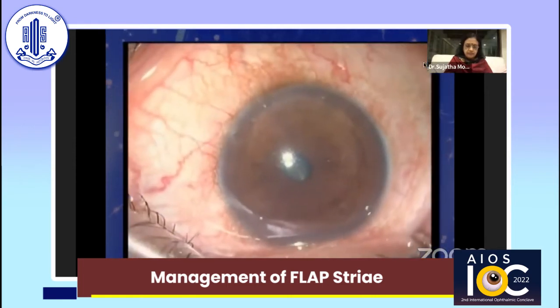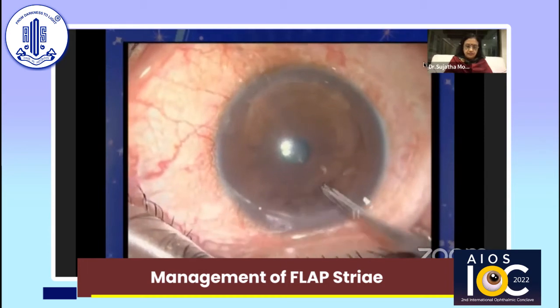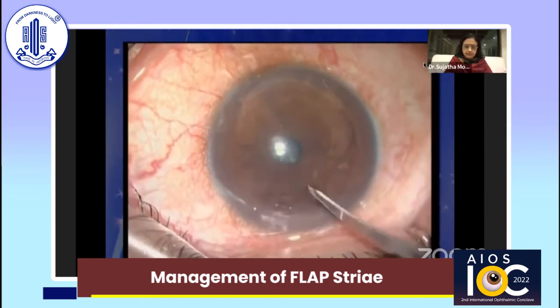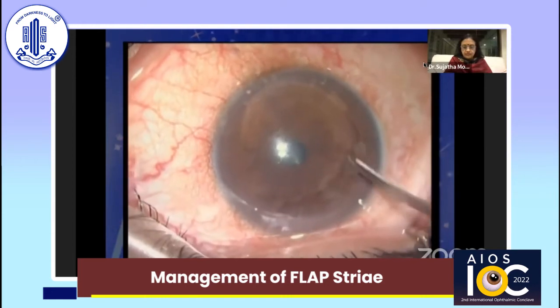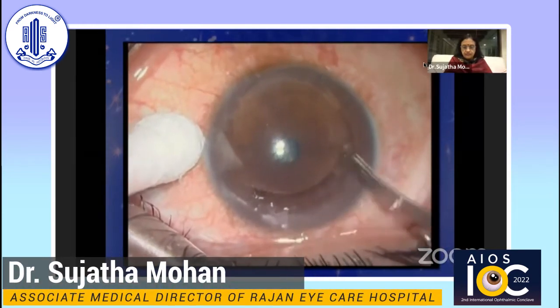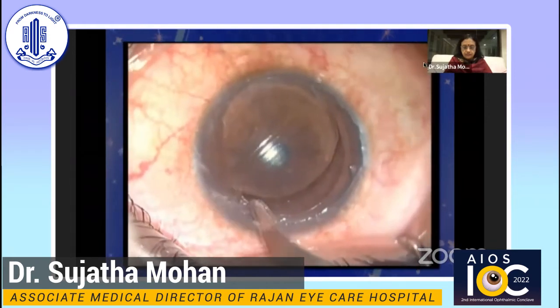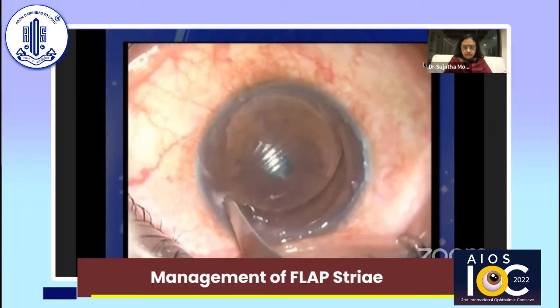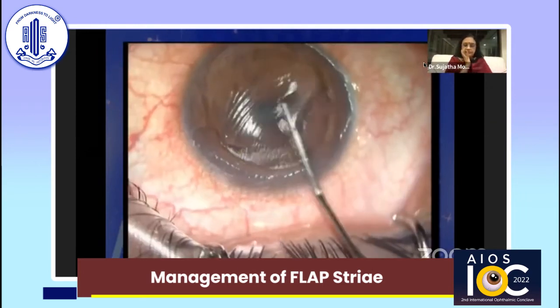The second case presented on the third post-op day with flap slippage and flap folds. Here the stromal bed is exposed with epithelial ingrowth. In this situation, the epithelium over the exposed bed is meticulously removed with a hockey stick knife before lifting the flap.